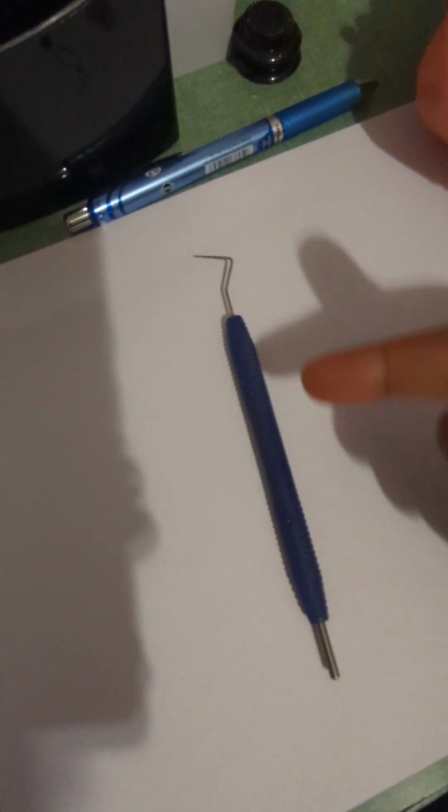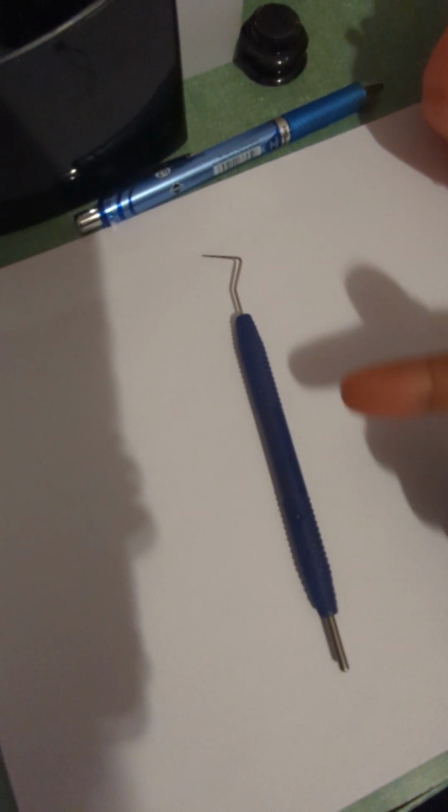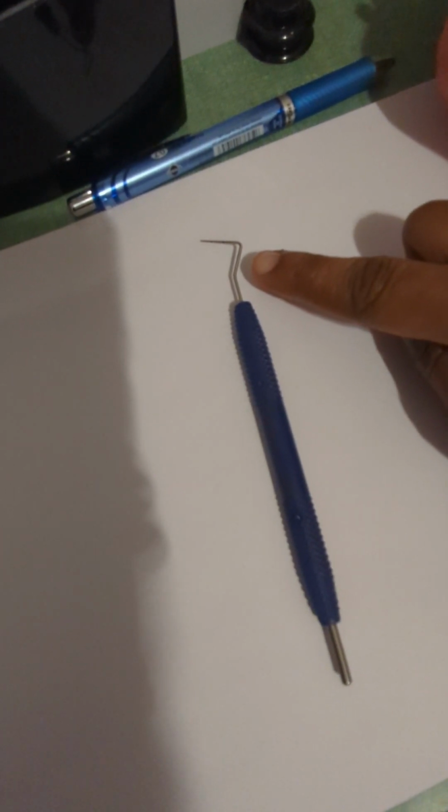So first, we'll start off with the blue area over here, and that would be the handle, followed by the area over here, which is our shank. And finally, at the very end, we have our working end.